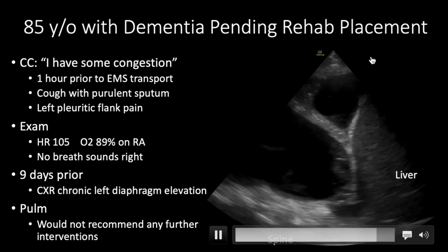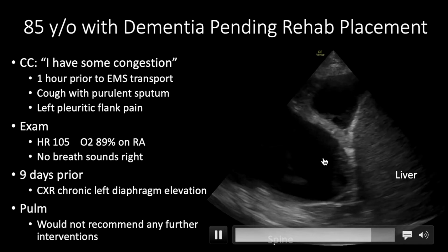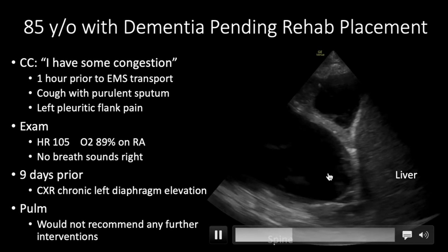But I think when we're looking at this patient and he's got septations, cough, sputum production, and tachycardia, I'd be very worried about an empyema in this case. And I decided we should probably work this up a little bit further.